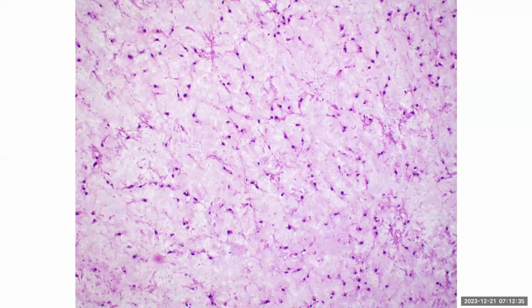So as you mentioned, this is a chondroid tumor. You can see from the matrix, the background, that there's this myxoid material, and there's a sprinkling of cells that don't look so atypical. They have round to oval nuclei and elongated, very sort of stubby processes. And overall, it's mild to moderately cellular. And this will be important for grading. I don't see any mitotic figures. I don't see very extreme nuclear atypia.